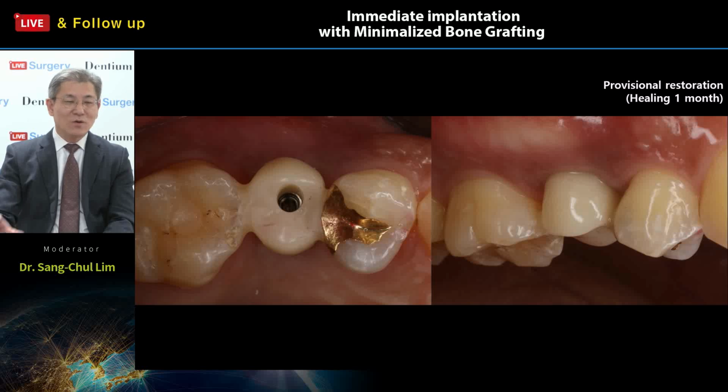It depends on the rigidity, angulation, situation, bite force, and opposite dentition. So I think it is one of the good options, the resin splinted with a neighbor tooth. And for a minimum of 1 month or 2 months, and after that, changing with the final restoration of a zirconia crown.